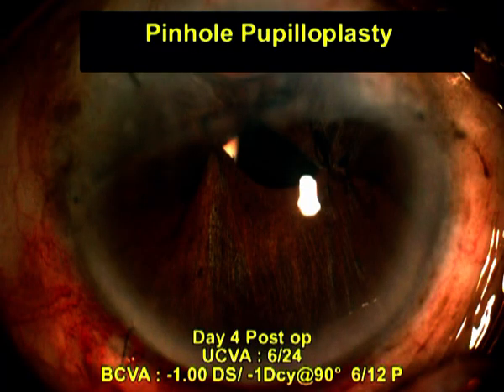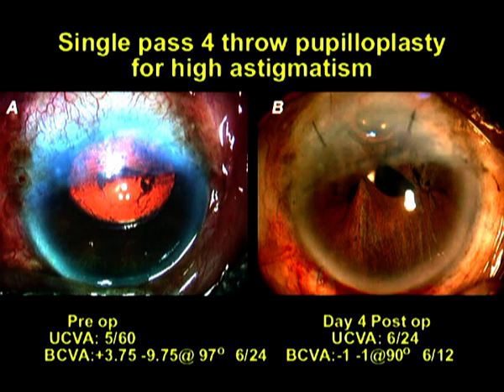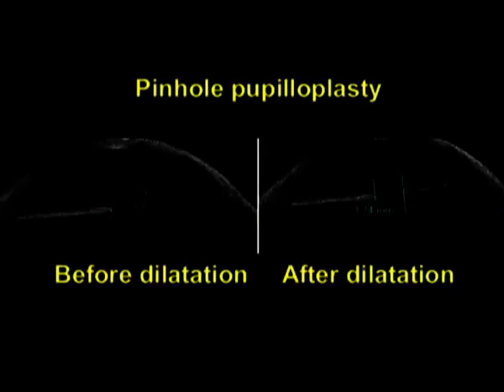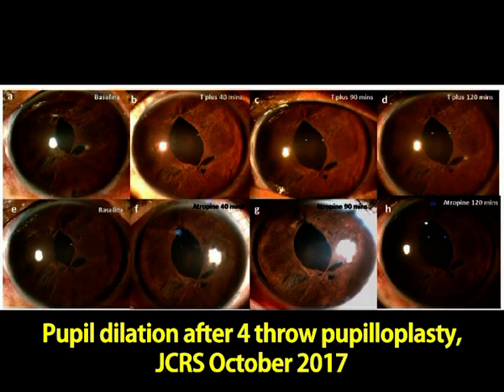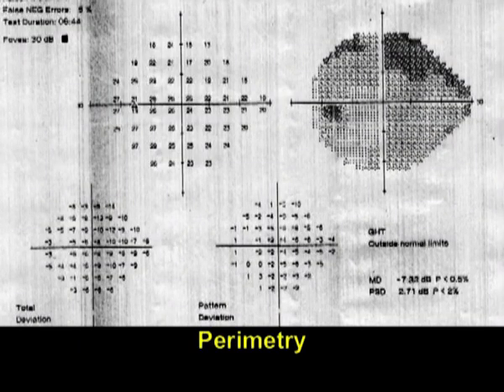Postoperatively, the vision improved to 6/12, though the Pentacam did not show much difference. With the pinhole effect, the patient sees the object clearly and well illuminated due to greater photoreceptor sensitivity as seen with the Stiles-Crawford effect. One can dilate the pupil a little bit after single-pass 4-throw pupilloplasty, helping in fundus examination, as published in the October issue of JCRS 2017. Field defects are not significantly noticed after pinhole pupilloplasty.